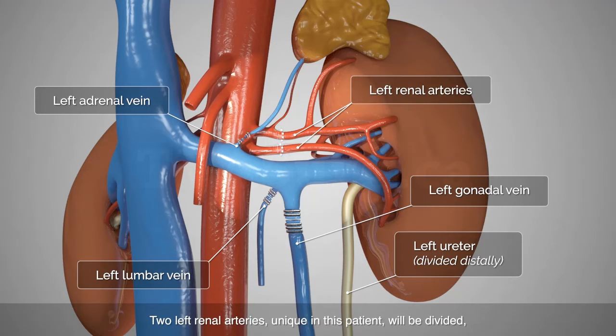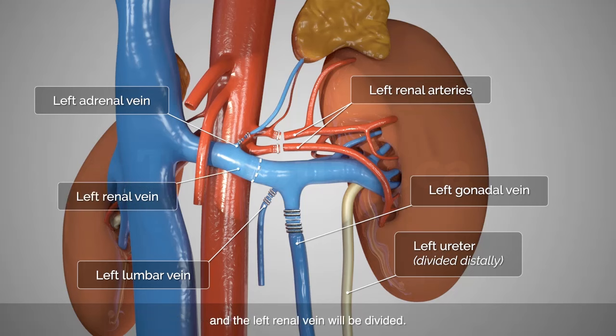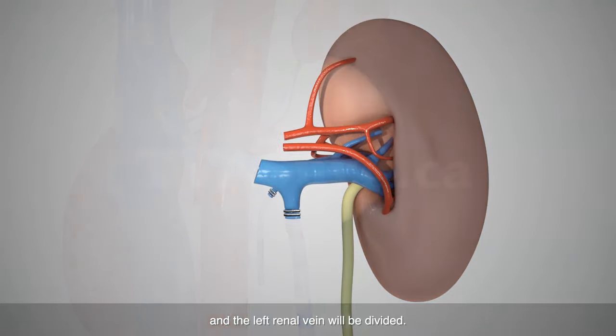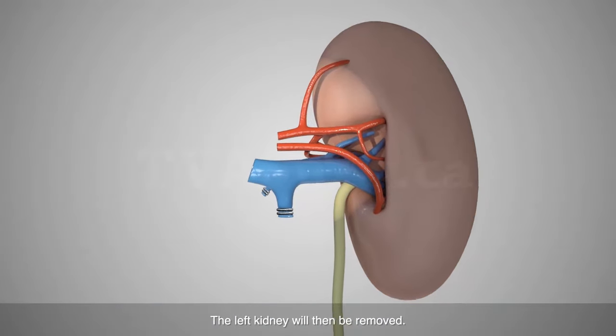Two left renal arteries, unique in this patient, will be divided, and the left renal vein will be divided. The left kidney will then be removed.